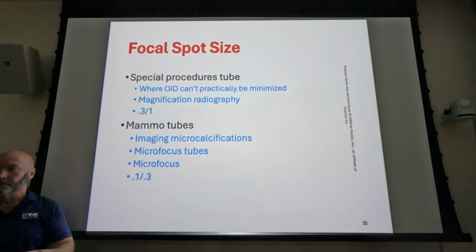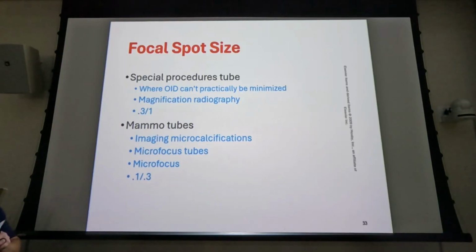So two differences. One is with macro radiography, we do not increase SID. With the air gap, we do. And number two, the purpose for the air gap is to get rid of some of the scatter radiation. We increase the SID to overcome some of the magnification. Okay?